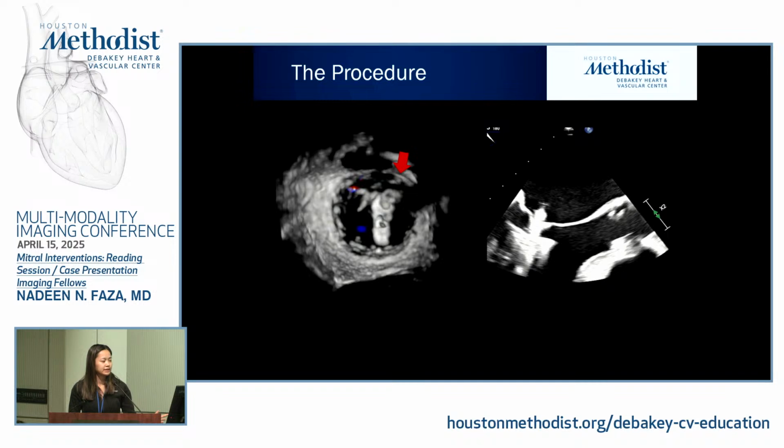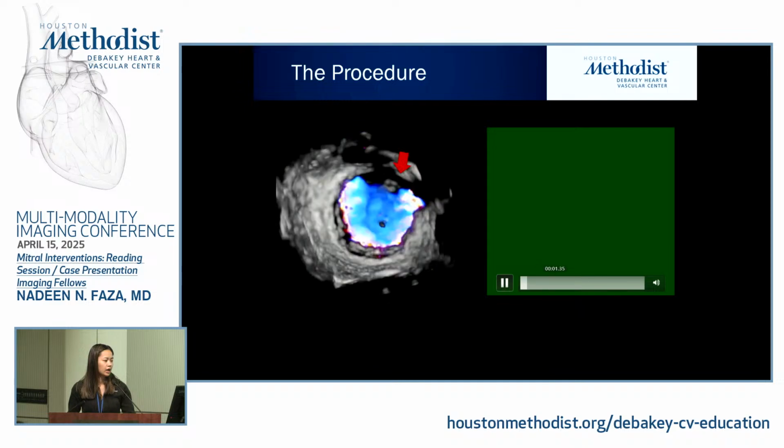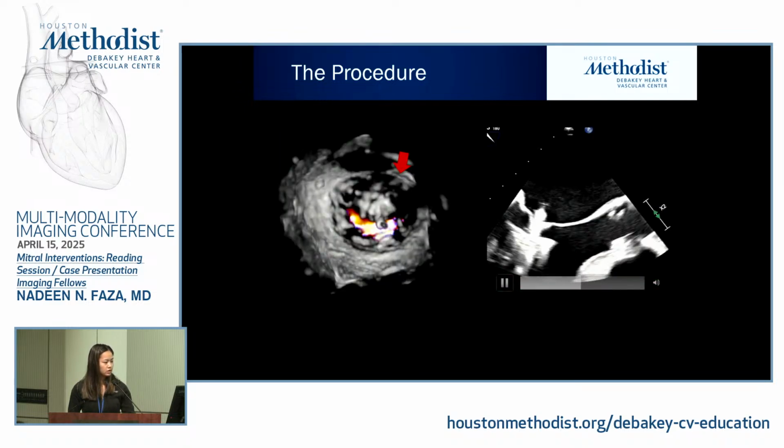So we released the arm and decided to change the strategy. So at this point, we felt that the one clip is not enough. So we wanted to move the clip more to the medial side, and then add on another clip more immediately lateral to that. So we'll release that and move the device a bit more medially, and repeat the procedure.